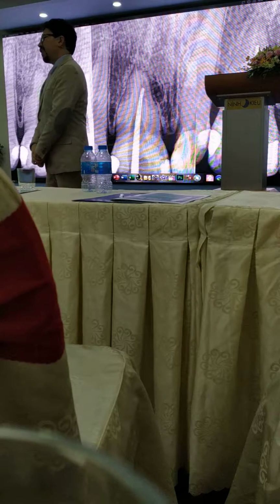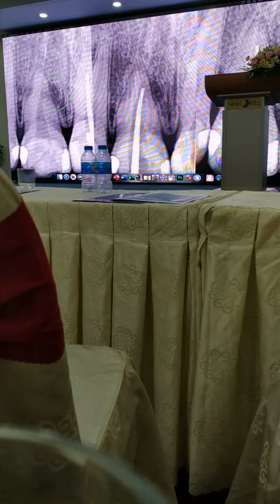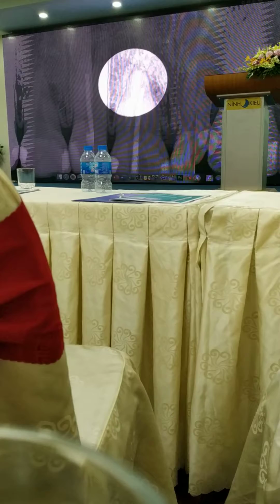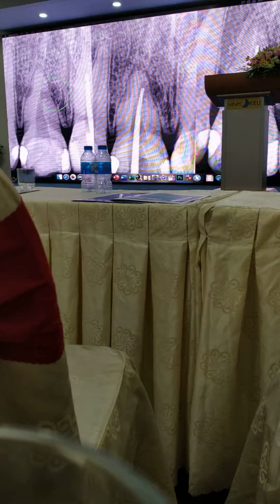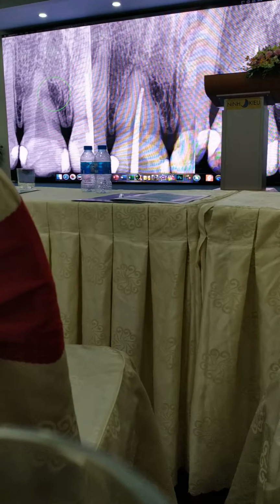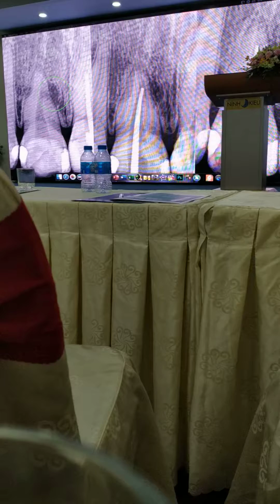So I stopped for a while and started thinking, what can I do here? Because the tooth was necrotic. If I performed my obturation only to this level, all the bacteria here would start growing and the treatment wouldn't be successful. So I decided, okay, I will use a bioceramic sealer.